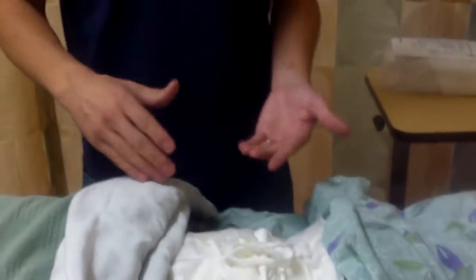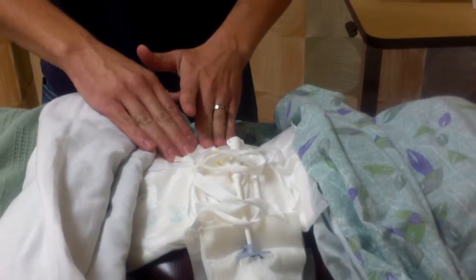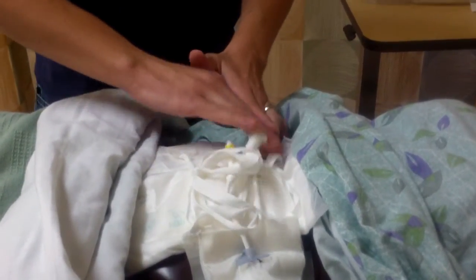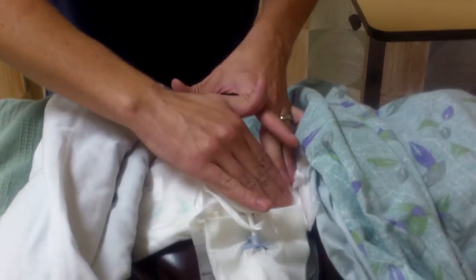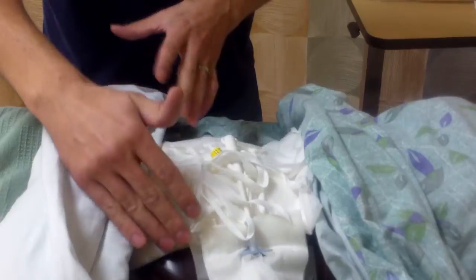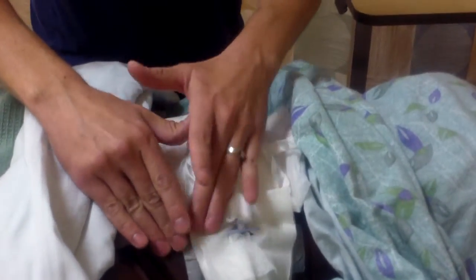And then I would also do some light palpation, noting if there's any kind of guarding or any kind of masses that I couldn't see before. Just going to do some light, starting in the lower right quadrant, working my way around. Trying to stay away from the bladder, because I do note that it is very distended, which is the reason for this catheterization here. So that's all good.